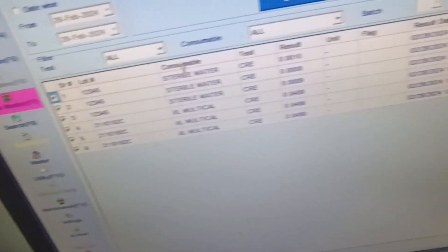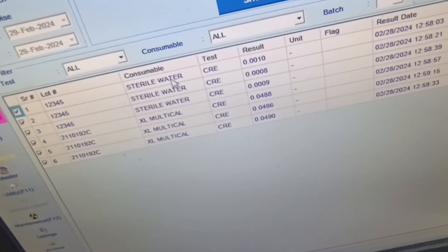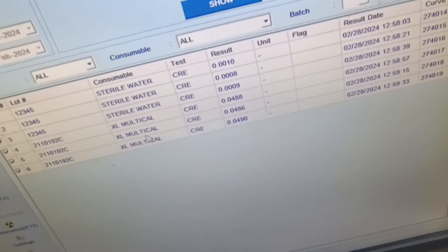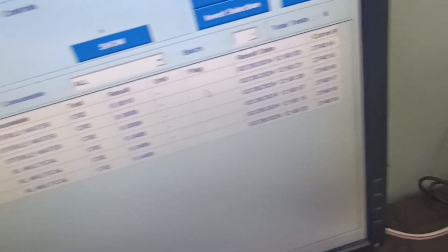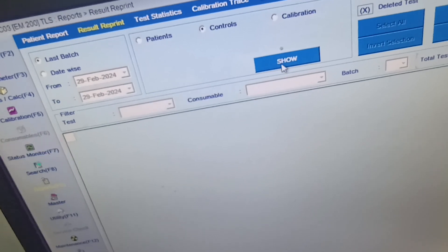Look at the calibration report. You can see the OD values of the result measured three times, and the OD values of the XL Multical also measured three times. This is the final result. You can also check the control result here.